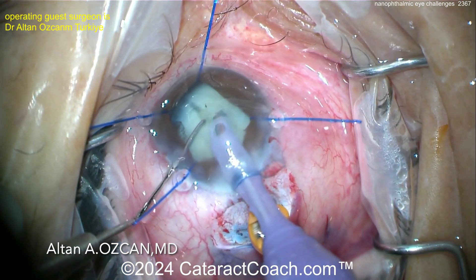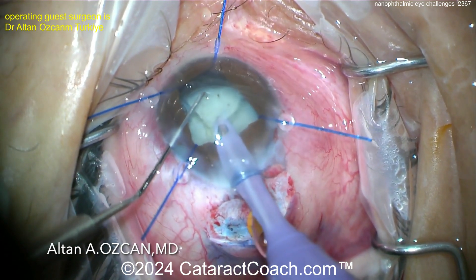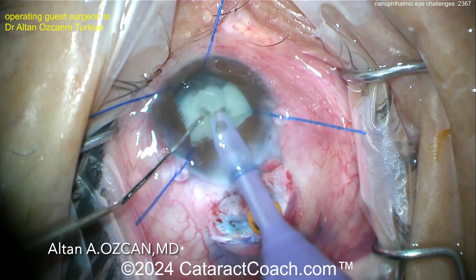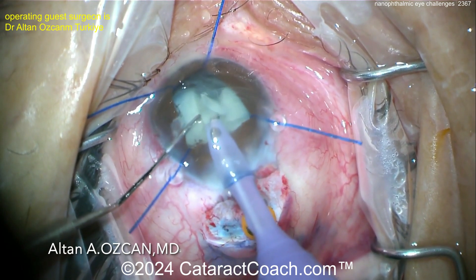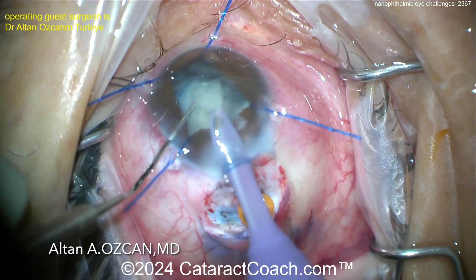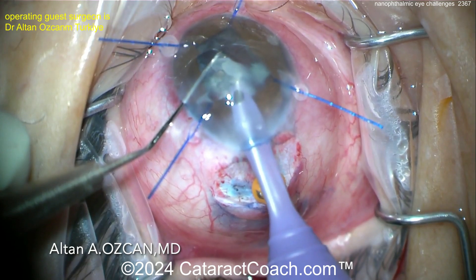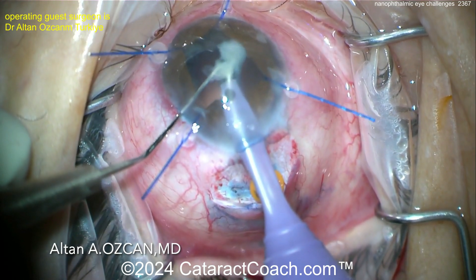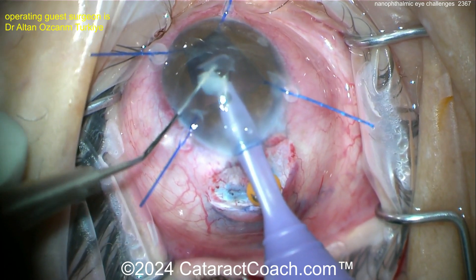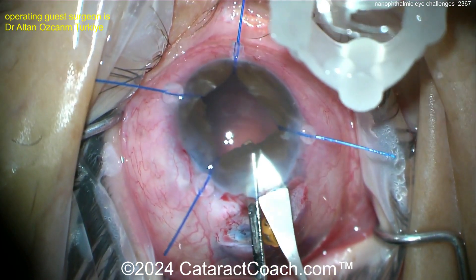Going in with the FACO probe, which just looks massive — beautiful chop. In a case like this, you may want to consider more than your typical topical anesthesia. You can do retrobulbar if needed, just be careful with the volume you inject. You can even do this under general anesthesia. Some surgeons will also make a small window to help prevent choroidal effusions, which are common in these tiny eyes. In this case the surgeon didn't elect for that — probably not needed, but it could be beneficial. Taking out these pieces, I like that chopper placement to protect the bag.